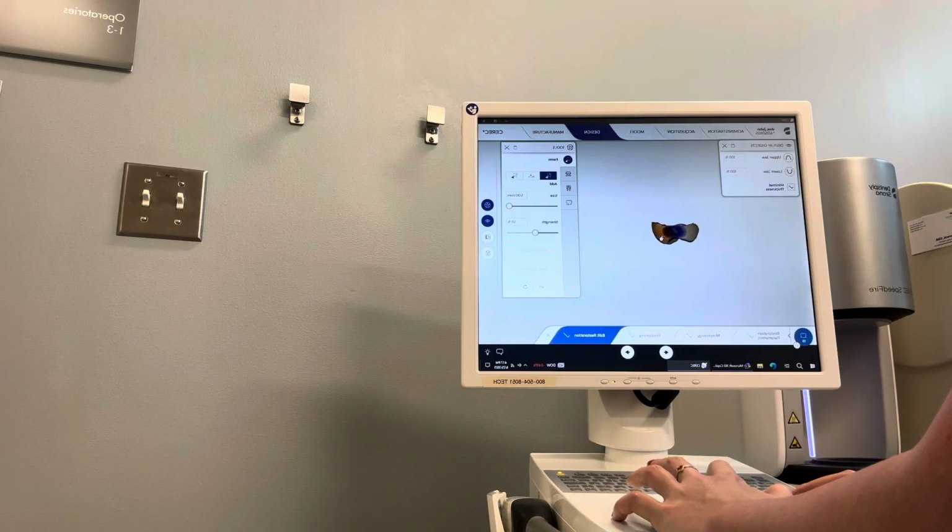And if you don't have any green, it's just blue, the contacts are probably going to be too light. So just a little bit of green is a happy medium, and that's where I'm going, trying to keep green, but also smooth out a little area of red that I had on one of the contacts. So I'm just adjusting that here.